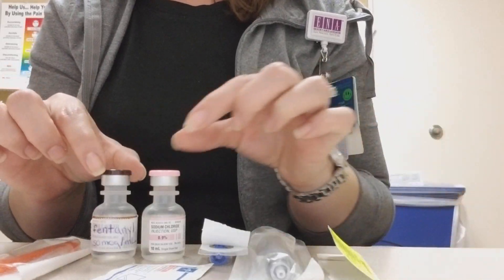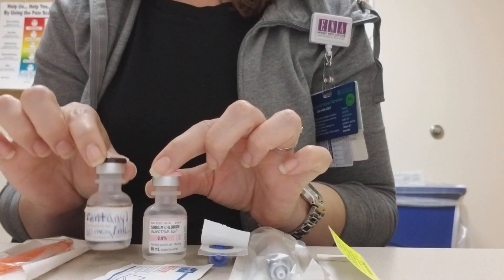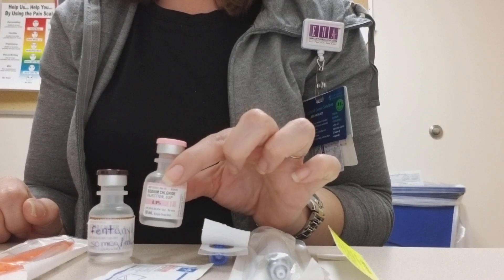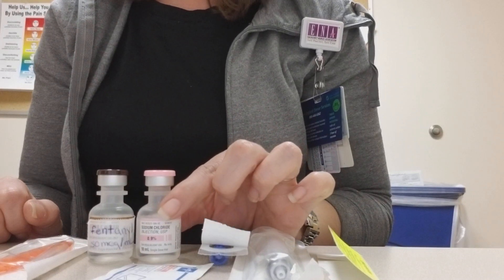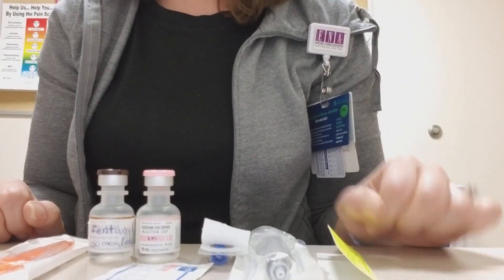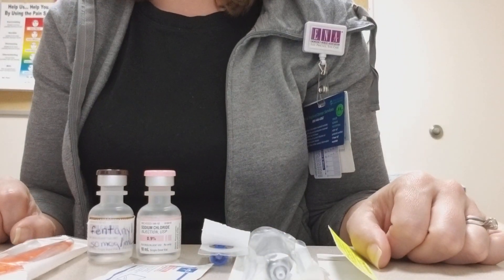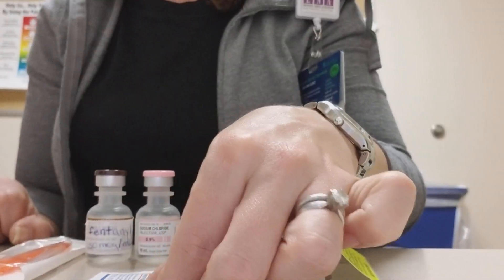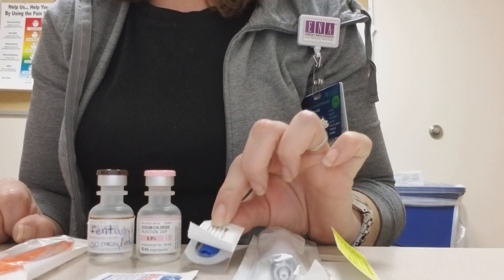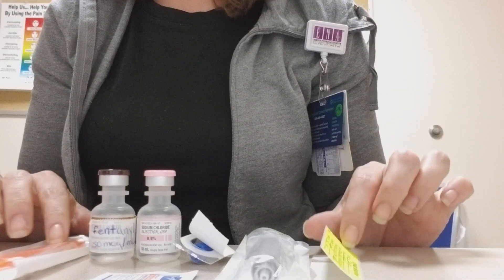So really quickly, I've gathered all of the supplies that you need here. I have our medication — we'll pretend that this is a bottle of fentanyl. I have a bottle of diluent, so this is normal saline. We will have stocked on all of the departments and all the med prep areas bottles of normal saline as well as sterile water, depending on what your medication calls for. An alcohol prep pad, a blue cap for once the medication is prepared, a syringe, a label, and a needle.